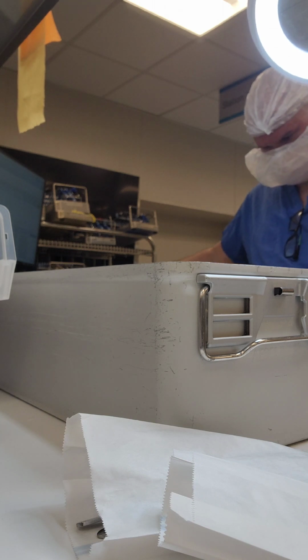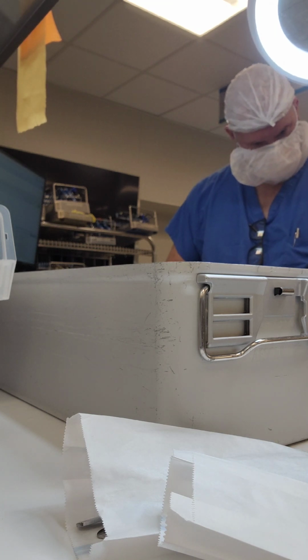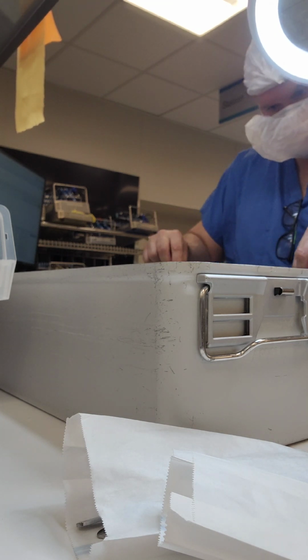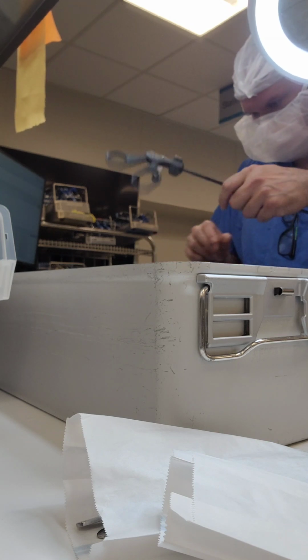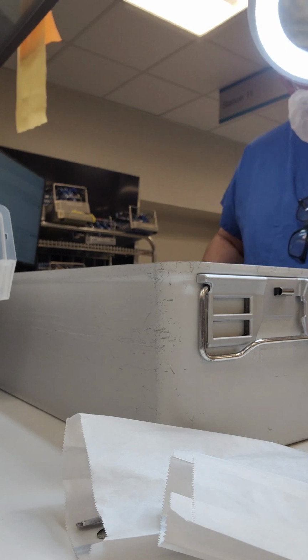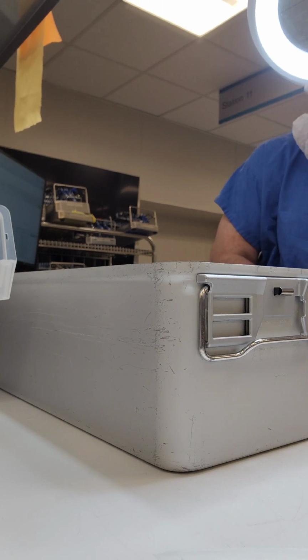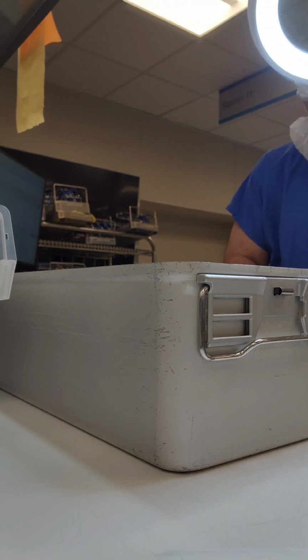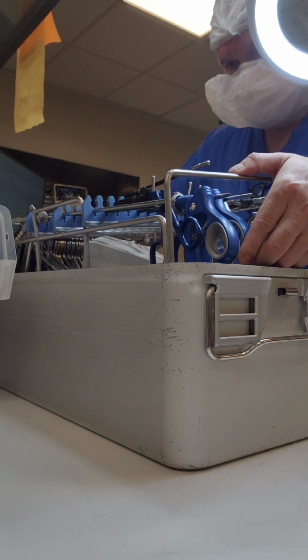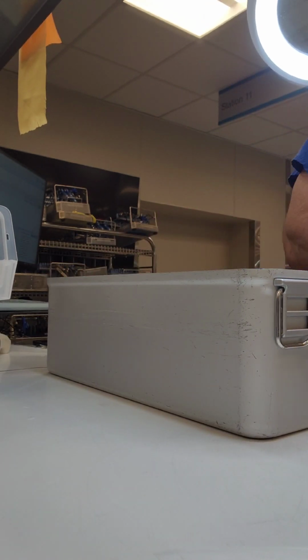All right, so you see me move that forcep. I'm actually going to slide that in the bottom basket there to take it off the top, because I saw that it probably was putting a little bit too much pressure on the lid. There's another forcep there that I found a little spot that I can just click it on in there. Then I'm going to go ahead and put the forceps back. I actually put the forceps in the basket instead of sitting it on top of the rack. I just slid it right there in the basket part of it. So I went ahead, slid that under there. All right, you see the bag is in the bottom now. So everything is sitting right. Nothing's sitting up out of that basket.